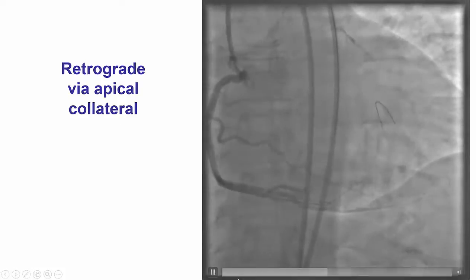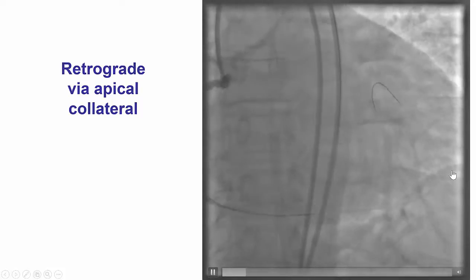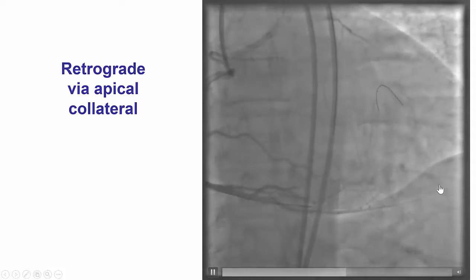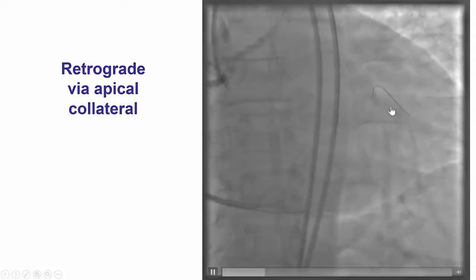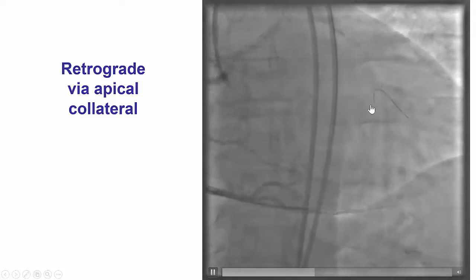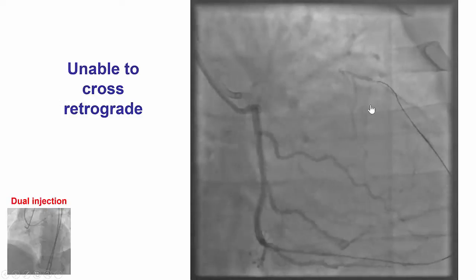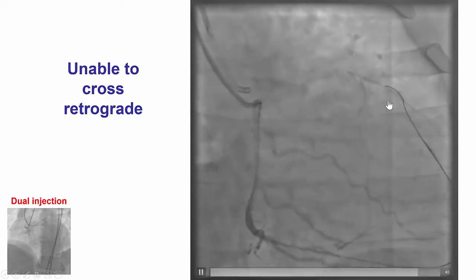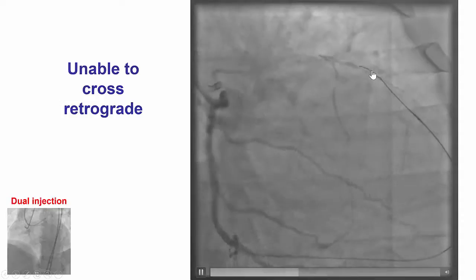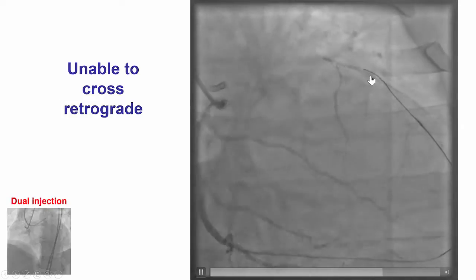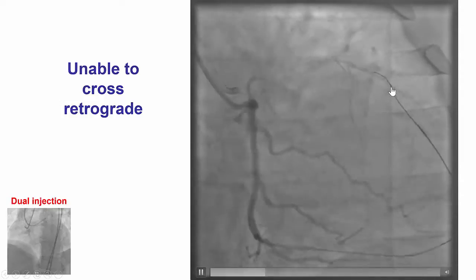We were able to advance a guidewire all the way from the apical collateral into the distal LAD successfully, as shown in this injection from the right. We then did retrograde wire escalation; however, the wire went into the subintimal space in the mid-LAD.